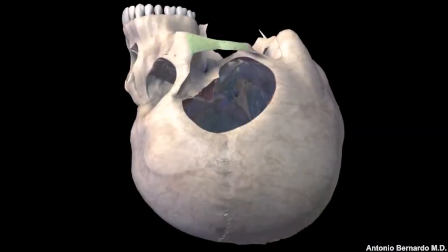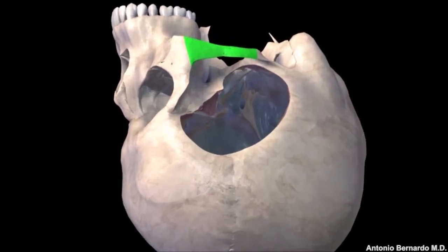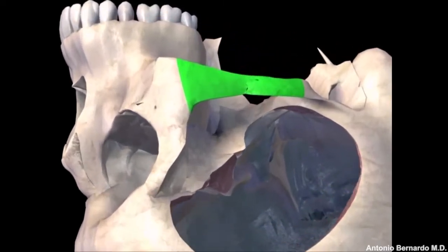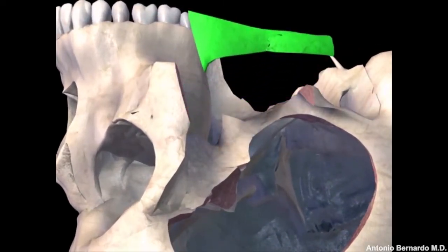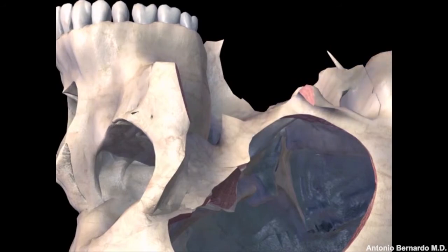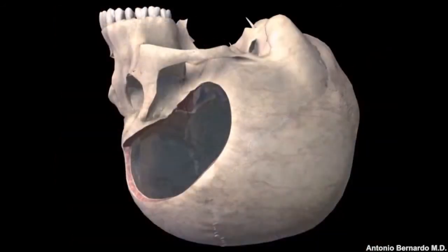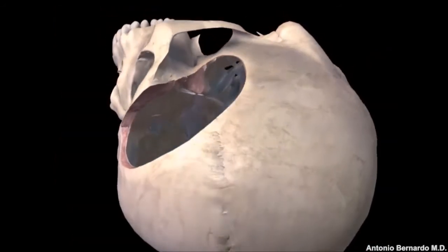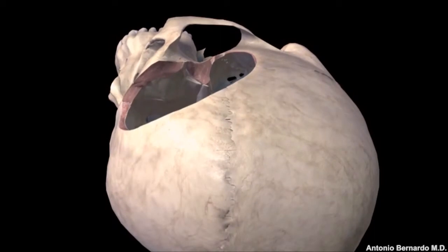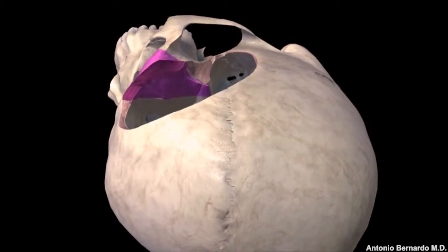At times, according to the pathology, small variations of the orbito-zygomatic approach can be performed — for example, the removal of the zygomatic arch only, or just the removal of the roof of the orbit.